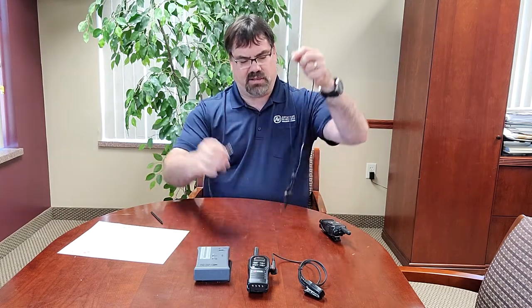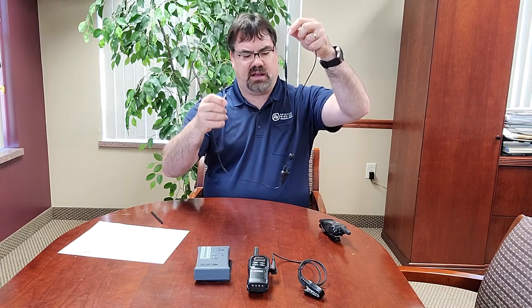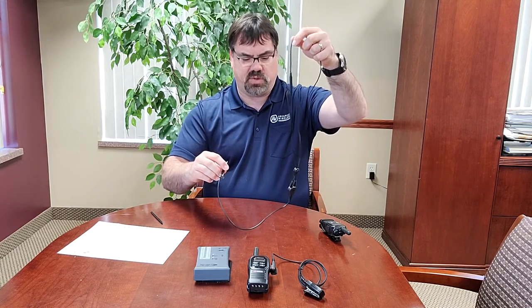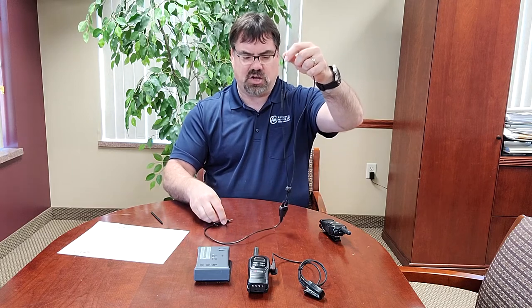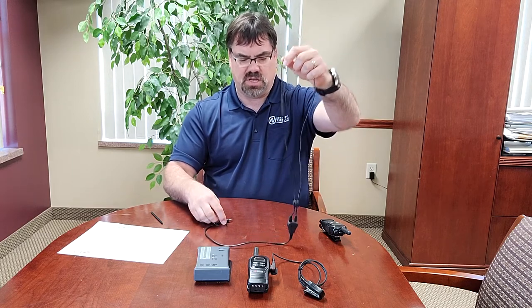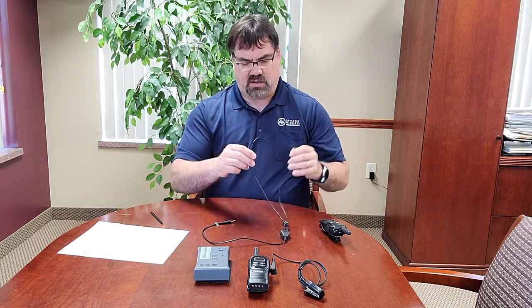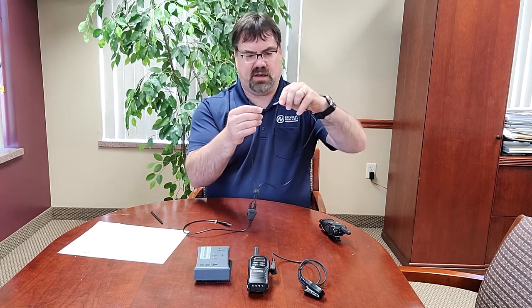So what we have done is we partnered with Williams AV. They have what they call a neck loop. The neck loop is an induction device that allows a person with a hearing aid that has a T-coil function to be able to use this loop and then they can hear a radio or other audio devices. This neck loop does have a breakaway, so if somebody were to pull it, they're not going to get strangled.